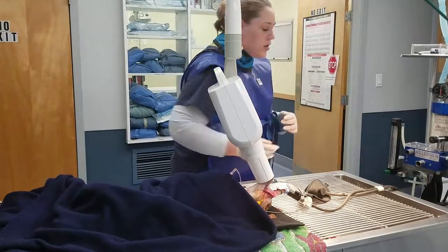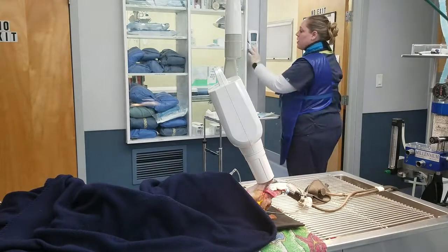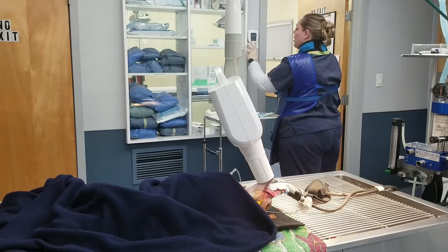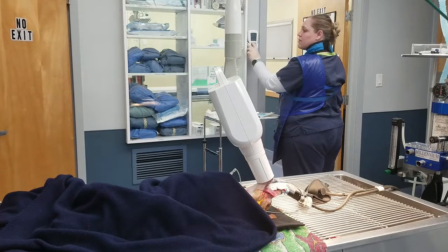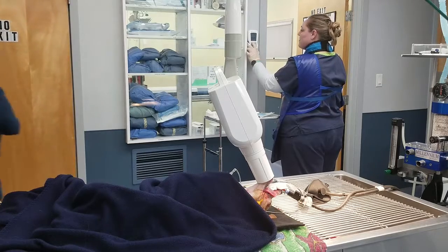All right. Hold on one second, we're shooting an x-ray.